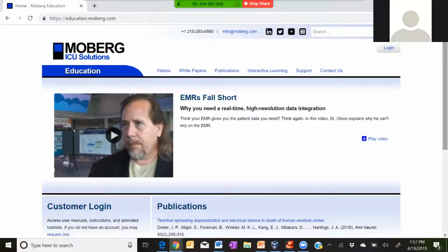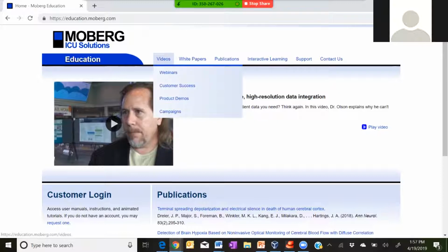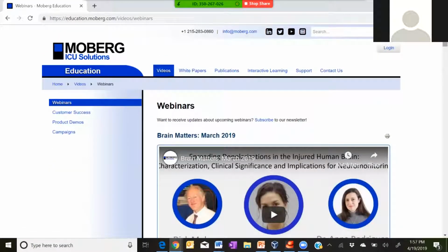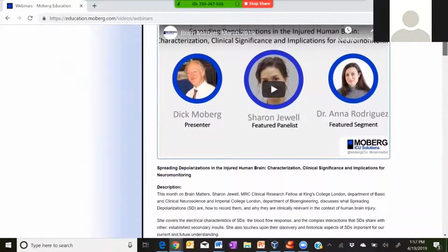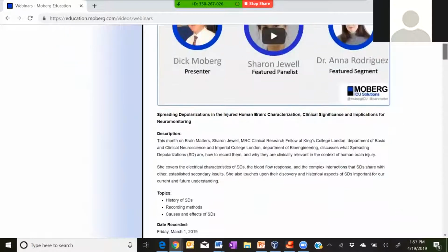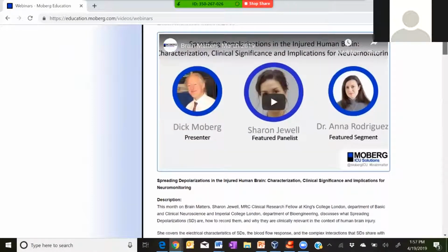And we always have a picture of Di White Olson there, which is awesome. And up here where it says videos, this tab down to webinars. If I tap webinars, Moberg also offers a series of webinars called Brain Matters, and they usually do those every month, and they typically have a physician or a researcher or an advanced user do some type of demonstration or some type of lecture. And Kathy had mentioned Anna as being our CNS Reader expert. So if you are going down the path of using the reader or Envision, then Anna will be the one that you're working very closely with.